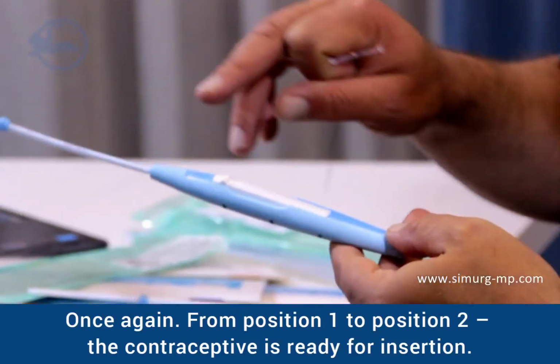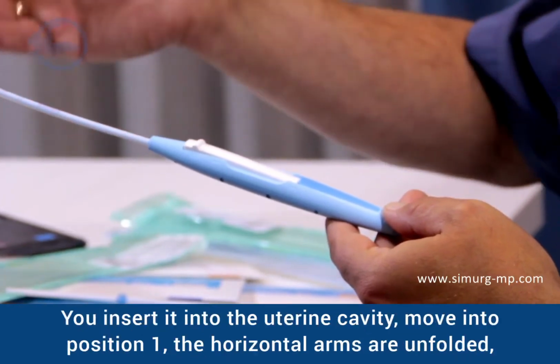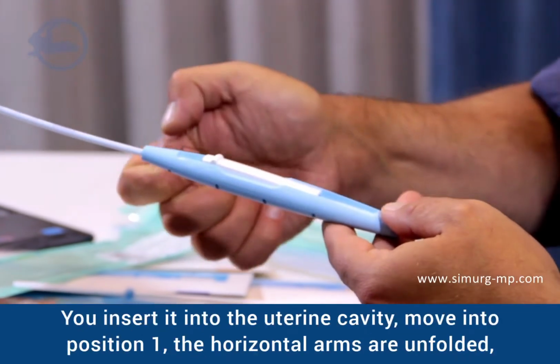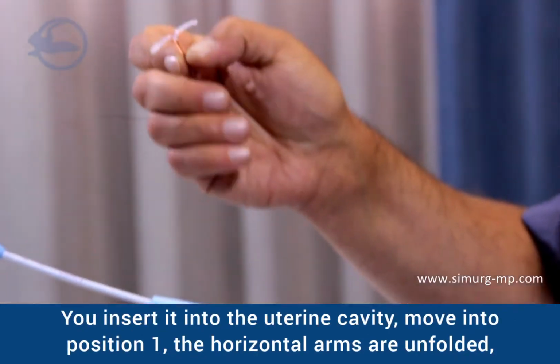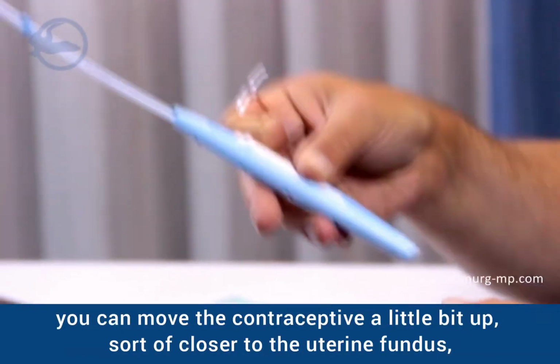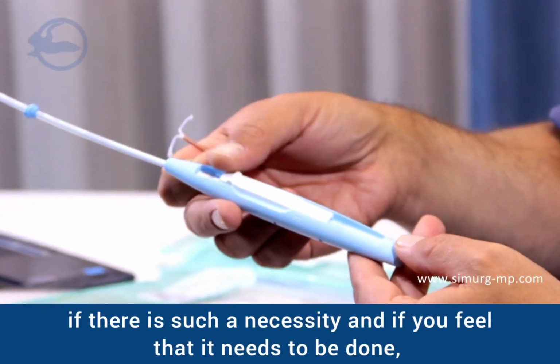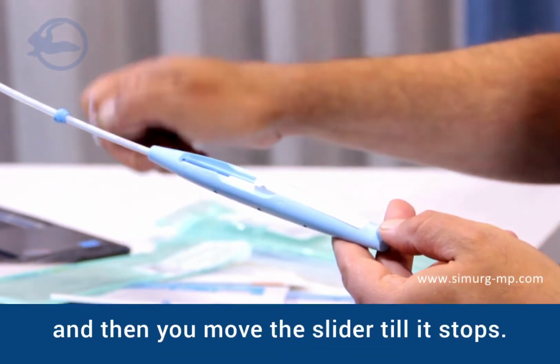Once again, from position 1 to position 2, the contraceptive is ready for insertion. You insert it into the uterine cavity, move into position 1, and the horizontal arms are unfolded. You can move the contraceptive a little bit up, closer to the uterine fundus, if there is such a necessity and if you feel that it needs to be done. And then you move the slider till it stops.